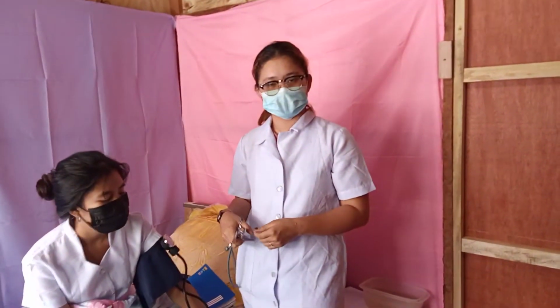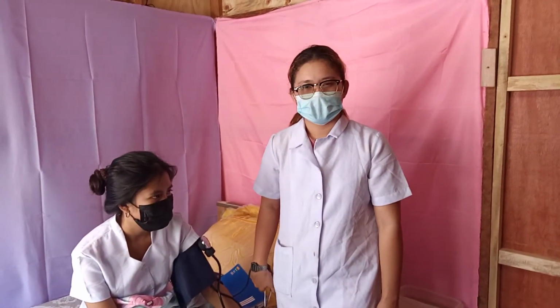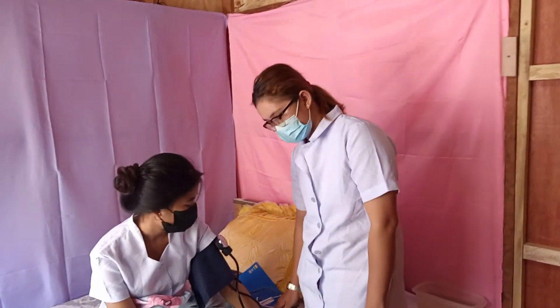The next procedure is, after the final sound has disappeared, deflate the cuff rapidly and completely. Rationale: to release the remaining air from the cuff and prevent congestion of the extremity.